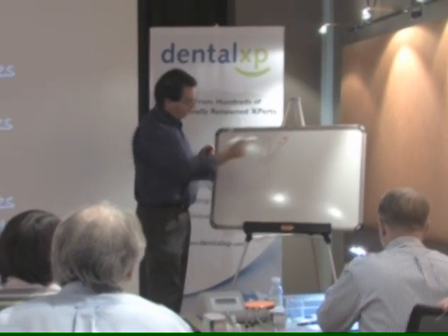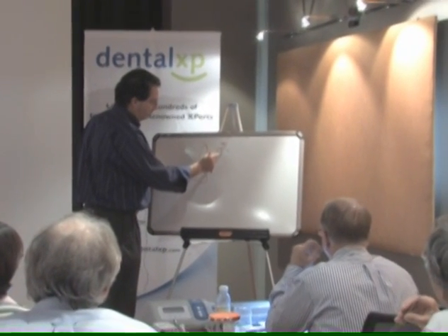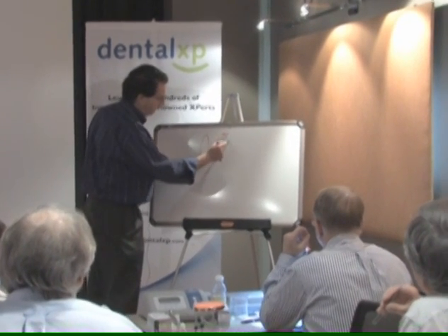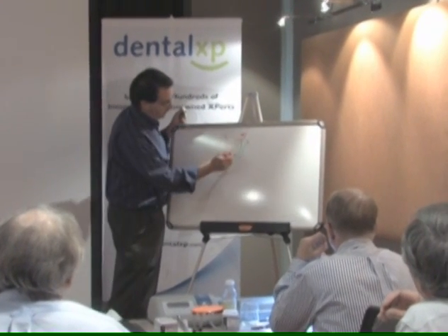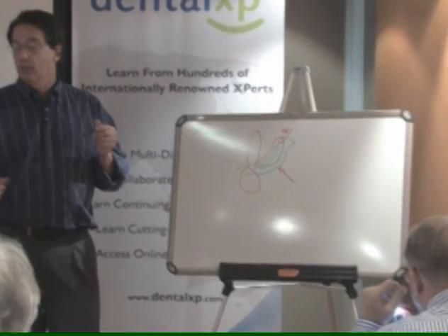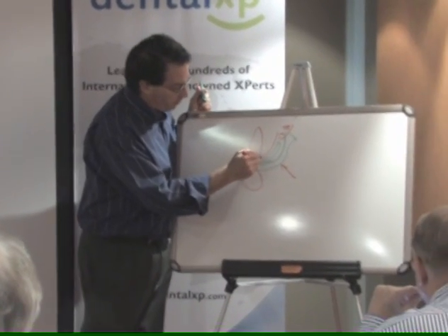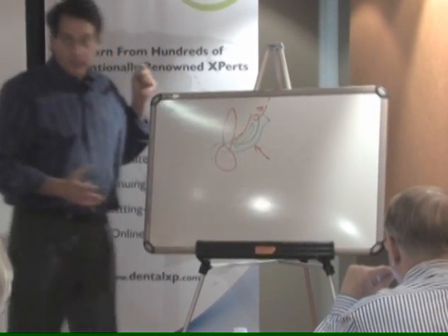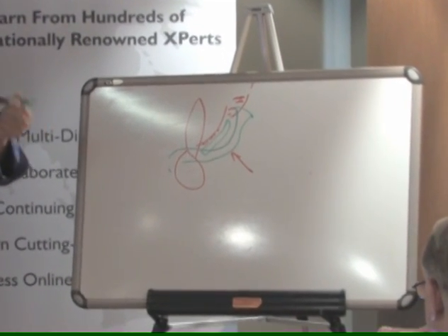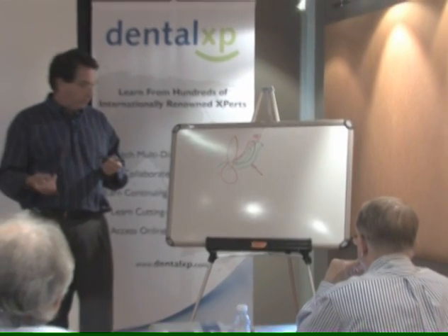What we want to do is pick up the periosteum, like so, come over the graft, come around, and then tie. So this suture here is going to pull toward the root, toward the graft, and eliminate what we call dead space between the graft and the tooth. Dead space is going to get filled with a blood clot. The blood clot may or may not turn into connective tissue, probably won't. It'll probably necrose and you're going to lose the graft.